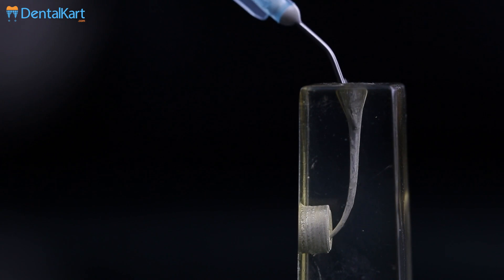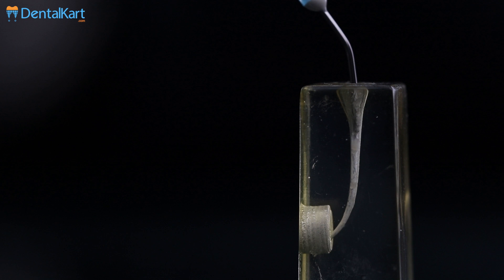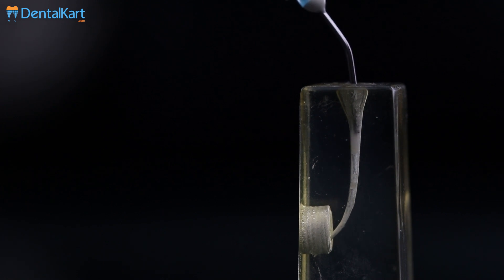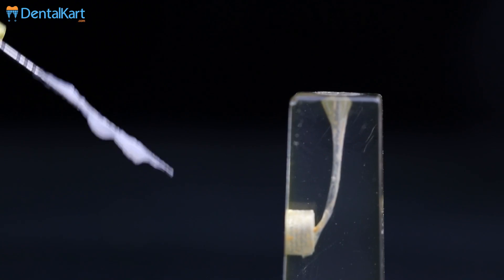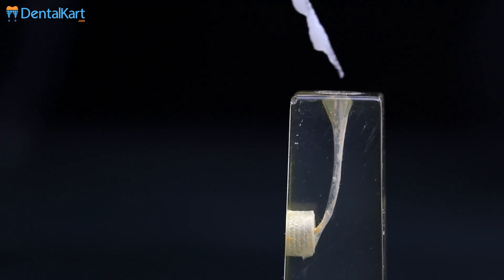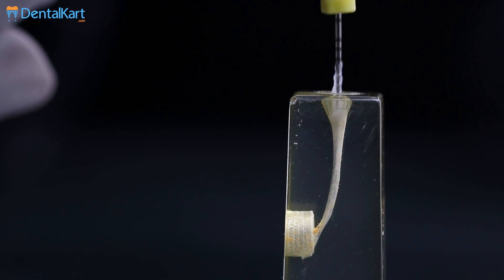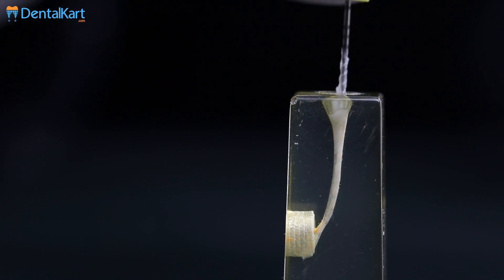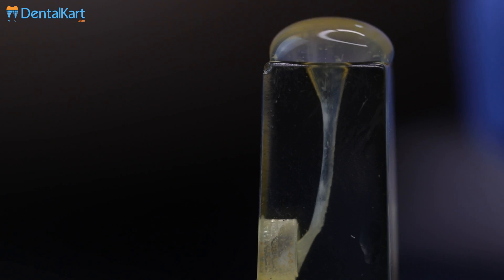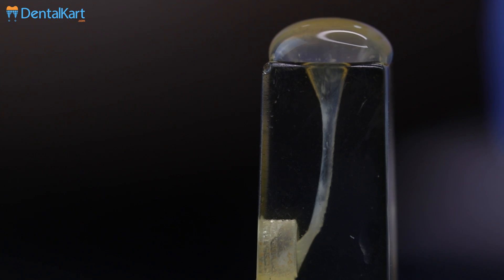How to use EDTA? A small amount can be deposited inside the canals using sterile applicator tips. It can also be applied by using files coated in EDTA gel. Action of EDTA begins after about 1 minute of its deposition.